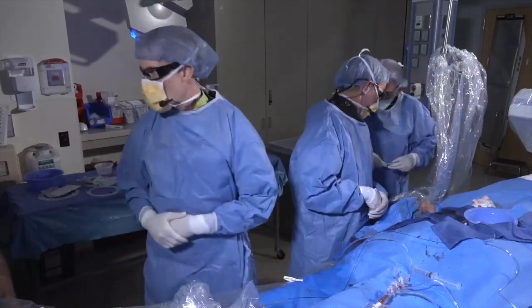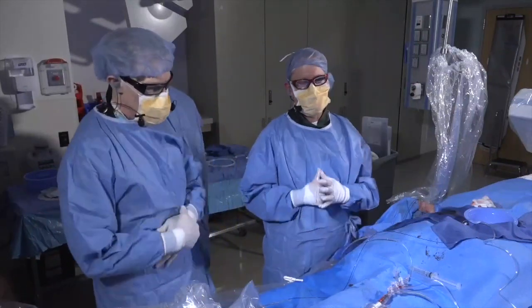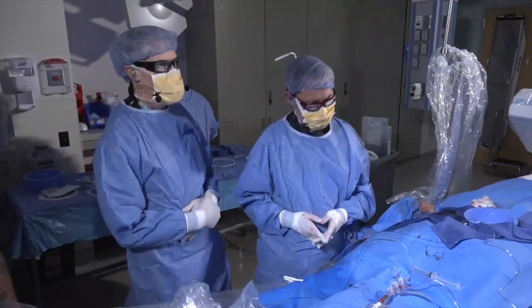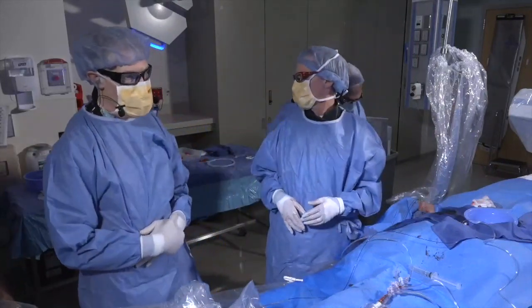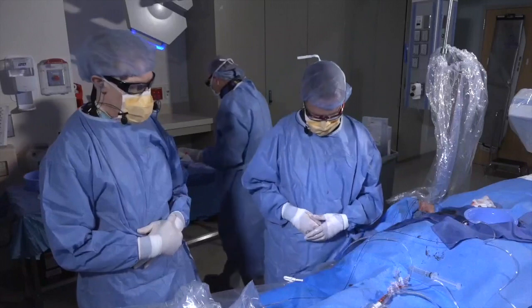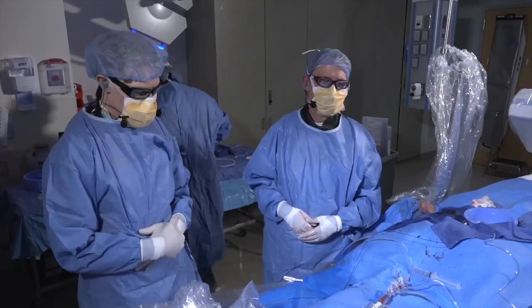The challenge with a 1.75 burr and a 6 is it's hard to test puff around the burr, but it definitely can be done, and it can be done radially. It's also challenging because you'll lose pressure. Your waveform gets dampened, and so it's a little bit hard, particularly in somebody who has soft blood pressure, to really know where they're at hemodynamically.